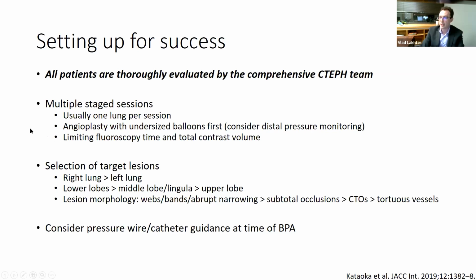When patients are ultimately selected to undergo BPA, there are several things that I think are important to consider in order to minimize the complications. And I think we certainly can help these patients with BPA, but we can also hurt them. So I think minimizing the risk for these patients is extremely important. And here are some of the things that I think are important to consider to minimize the risk.